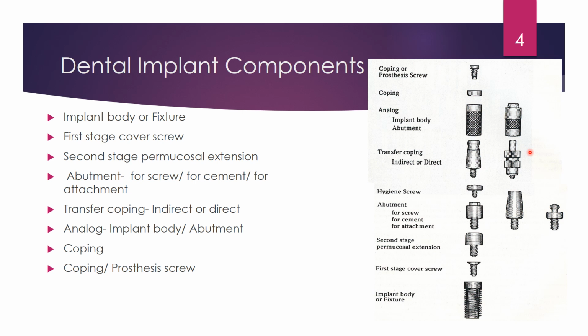Okay, so coming to the analogs, for the implant body and an abutment. An analog is basically a replica of an implant, abutment or attachment, usually incorporated within the cast for prosthetic reconstruction. So again, this is for the reconstruction. When we take out the transfer coping from our impression, we place the analog, that is the implant replica, inside.